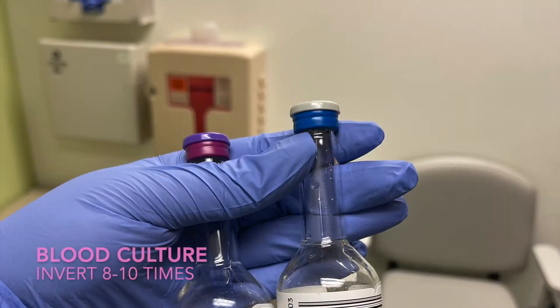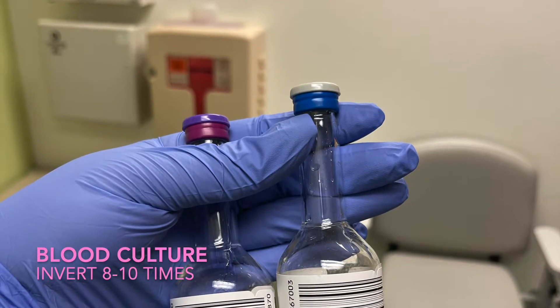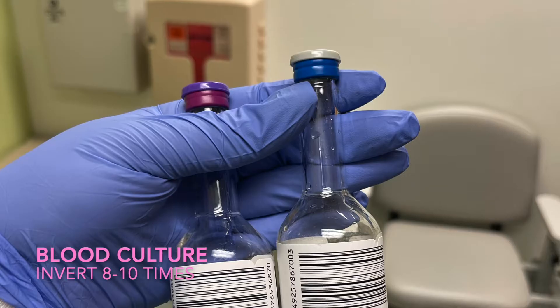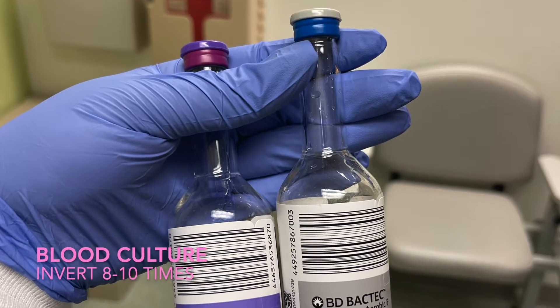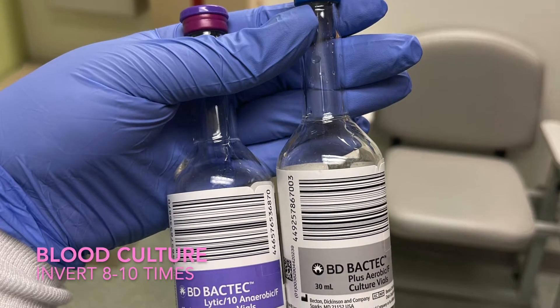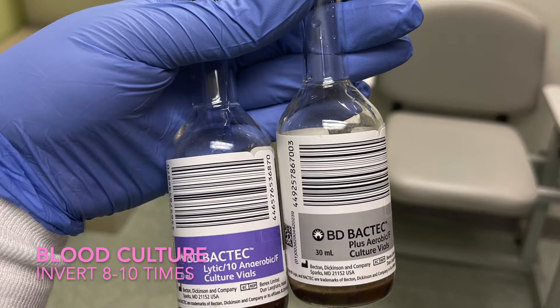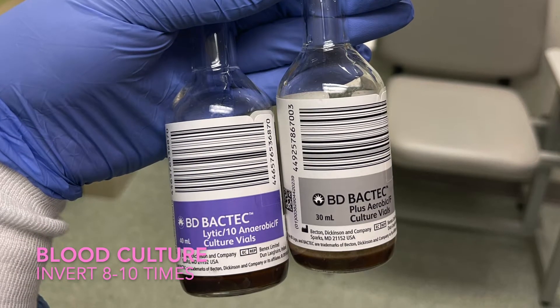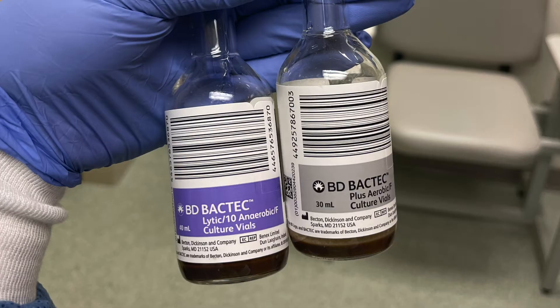Just some quick things to add about blood cultures: before collecting the sample, you must clean the skin with a chloroprep stick. Depending on your job, you may also need to clean the bottle with alcohol or chloroprep. This must be inverted eight to ten times. Blood cultures are used to check for infections. If you have a hard stick, it is okay to get the aerobic by itself so they can at least have one sample. When done, invert eight to ten times. Depending on your job, you may need to document how many ml's, your initials, and the site location.